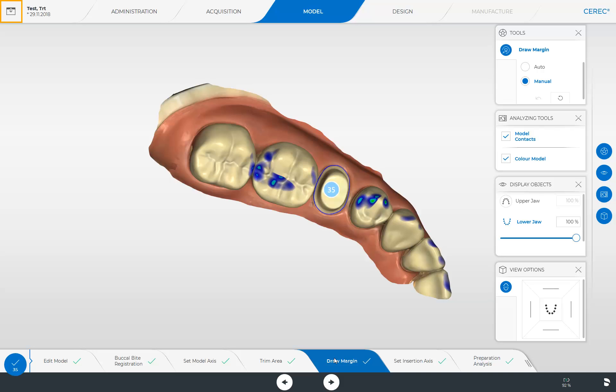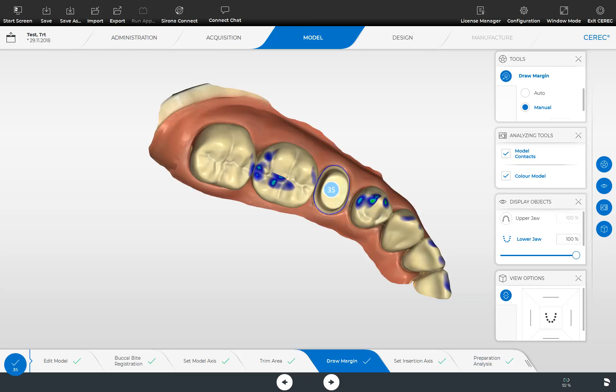Next, we switch to the System menu by tapping the icon at the upper left edge of the screen. In the System menu, we only look at the functions Save and Serona Connect. Should you not be able to complete the workflow through the Manufacture phase for some reason, you can save the case at any time in this phase and then retrieve it from the patient database later.